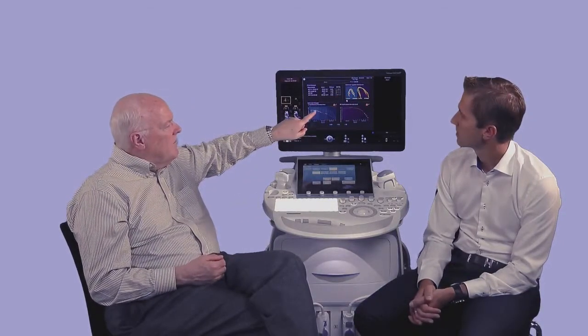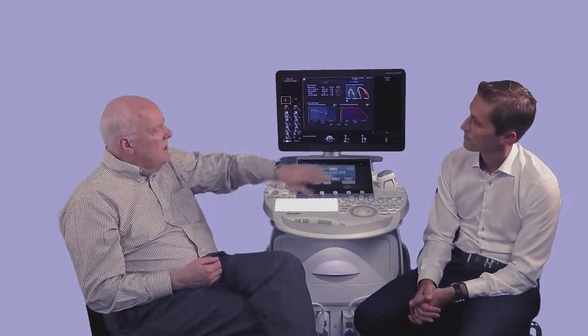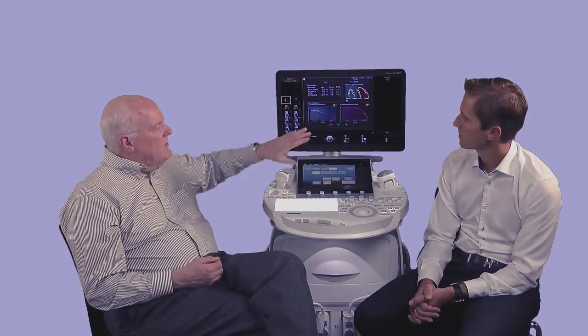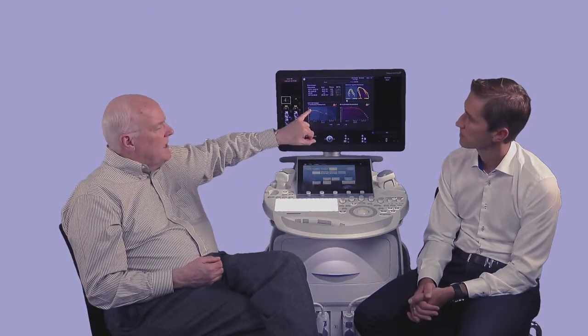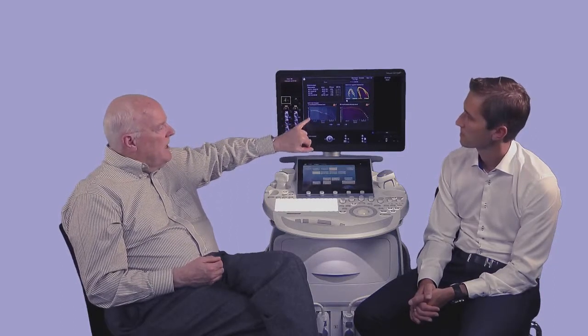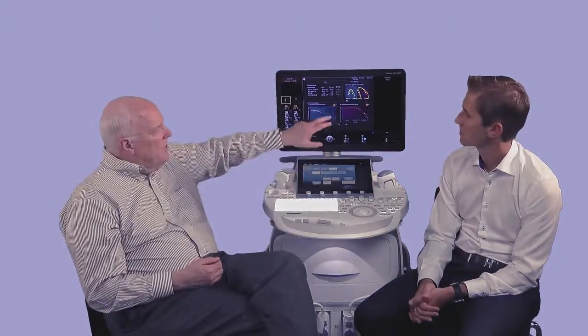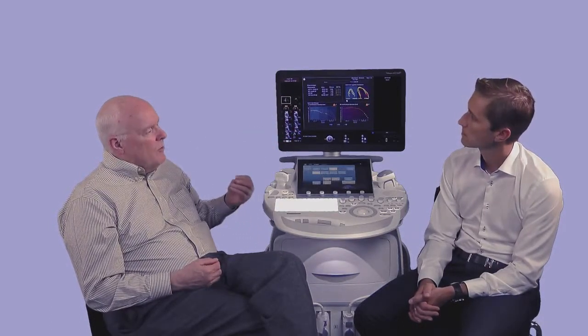The concept of 24 segments, dividing the heart into 24 equal segments from the base to the apex, no one's done that before. That's brand new. And looking at the sphericity index, everybody had published papers looking at only the first segment at the base of the heart for sphericity index. And we looked at 24 different segments, and we found that in certain situations, changes occurred in the mid portion or the apical portion of the heart that weren't present at the base. So we added a lot of things that nobody had ever reported. Brand new concepts of size, shape, and function.